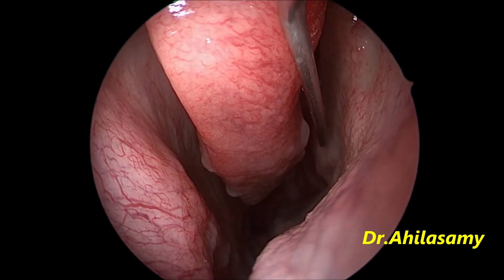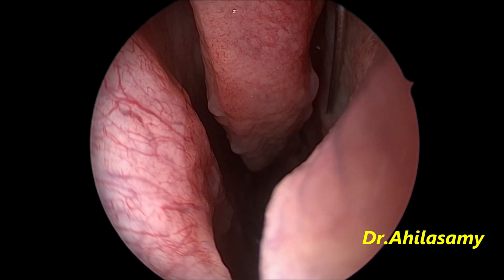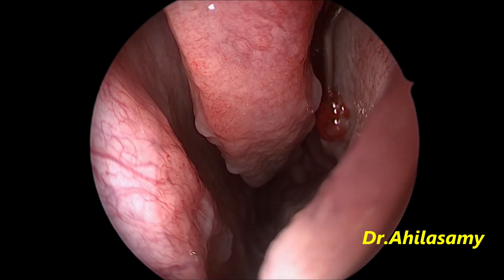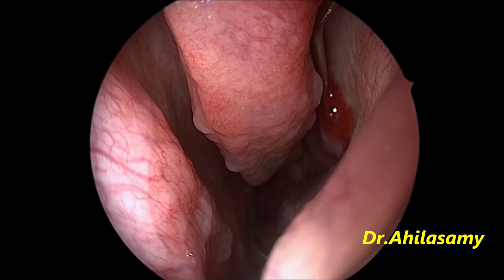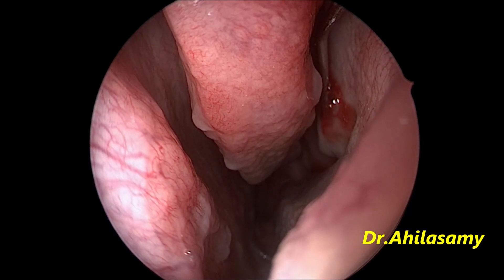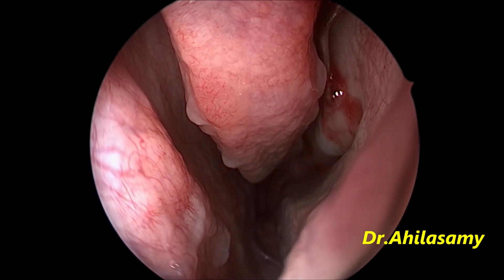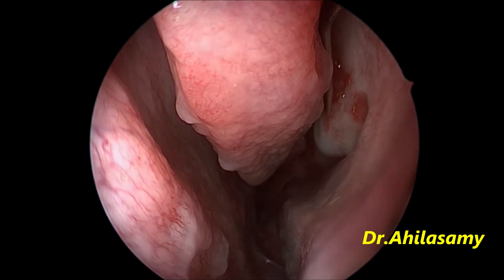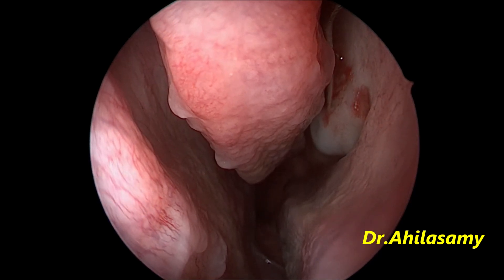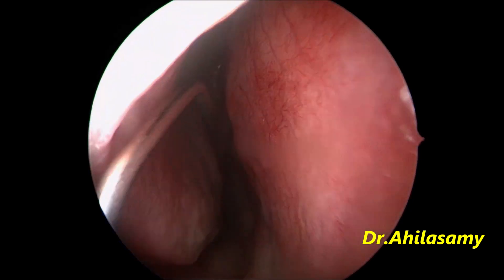Now I am giving the sphenopalatine block on the left side. It is quite easy because I have a lot of working space. Unless you give a good sphenopalatine or greater palatine block, you can't do nasal or sinus surgeries under local anesthesia comfortably, without the patient having pain.